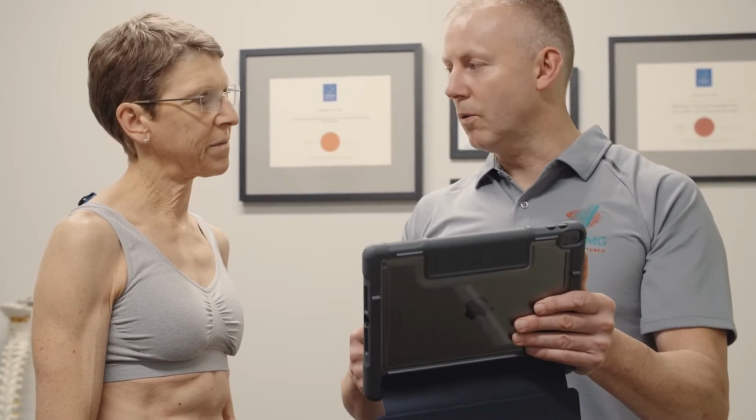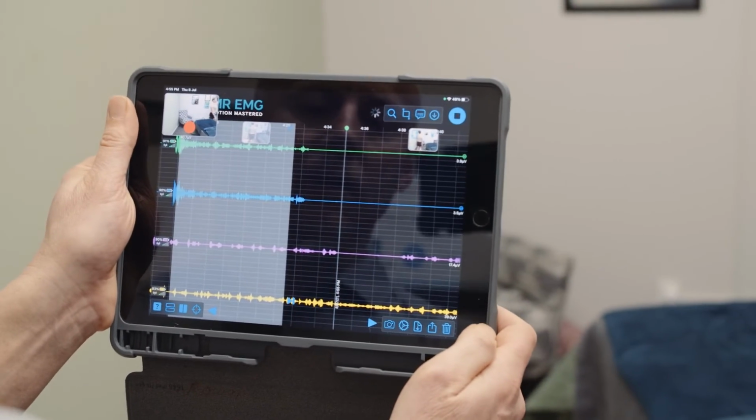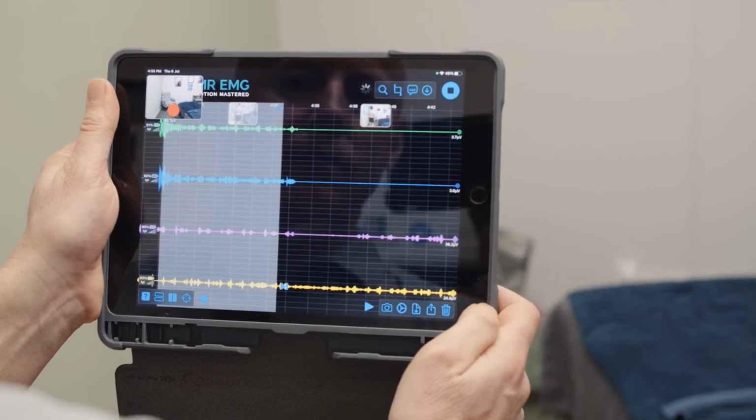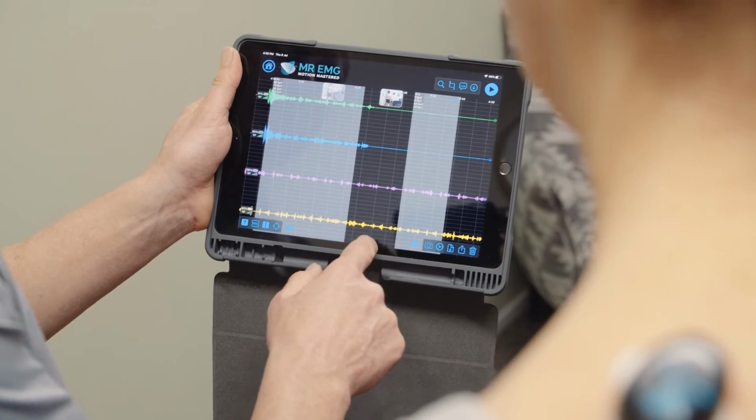If there is hyperactivity present, provide advice on postural recommendations, such as gently pulling the shoulders down when walking or standing upright, asking your subject to walk again and measure if there is an improvement. Show your subject the resulting EMG data recording of recommended movement changes.